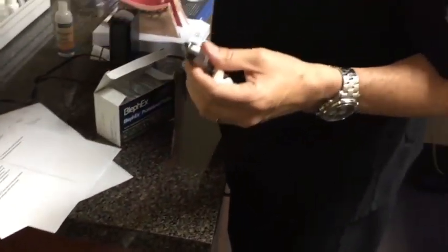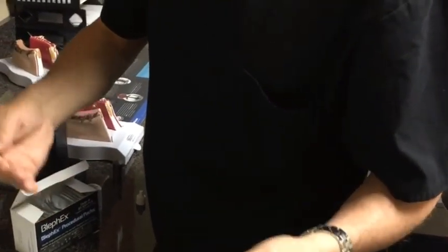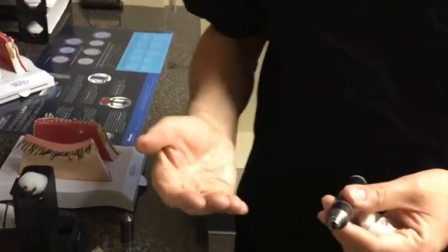And that tip now is full of everything we're trying to get rid of. Excess bacteria, virulence factors, those are the toxins that are causing the inflammation that are being produced in the biofilm, and the biofilm itself. And by doing that, reducing that bacterial load, we're actually turning the bacteria off. We're turning off their quorum sensing gene activation. That's one of the critical factors in inflammatory lid margin disease.